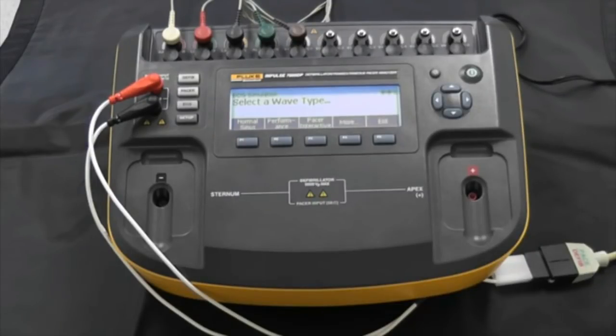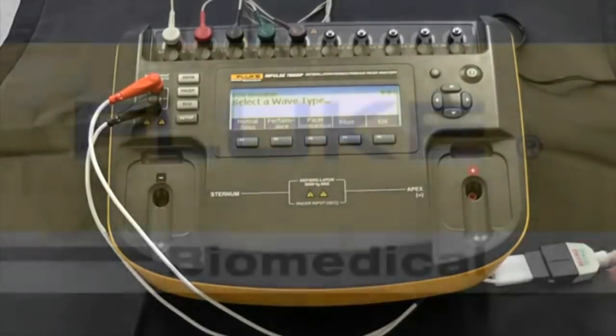At this point you've had a quick introduction to the Impulse 7000. You've seen a test for patient pacer parameters and a defibrillator output test. If you want to know more, go to flukebiomedical.com. From the product drop-down, pick defibrillator analyzer and Impulse 7000. You can ask for a quote if you're ready, or if you want to try this out on your own, you can ask for a demo and we'll make sure you get a unit to try out for yourself.